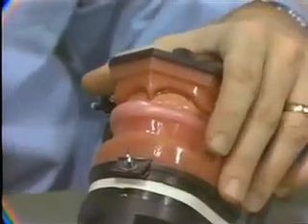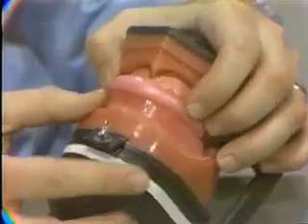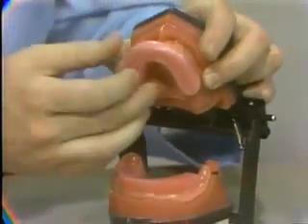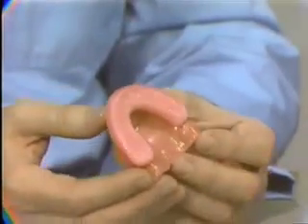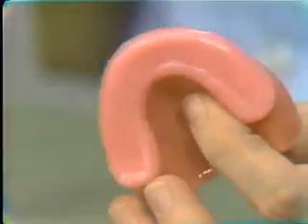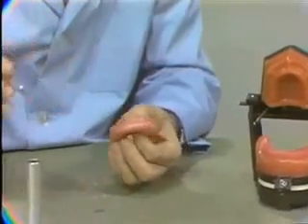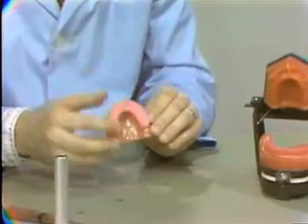At this time, we wait maybe a moment or two, but not too long, because we want the wax to separate. We have the patient open. Sometimes, as in the mouth, these come off together. If that happens, that's all right. But now what you can see has happened here is we have keyed in the upper base plate by using the lower cold or solid hard base plate, occlusal rim, the approximate configuration that we want to have these two wax rims come together properly. At this time, it is suggested that you seal a little better the wax occlusal rim to the base plate. So simply with a hot spatula, go around and seal the wax.